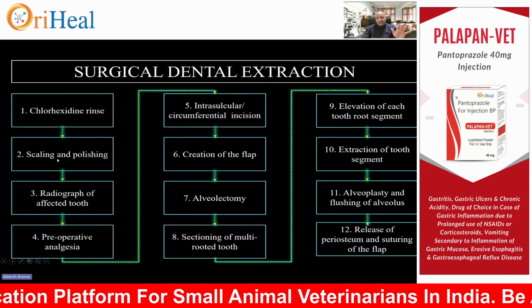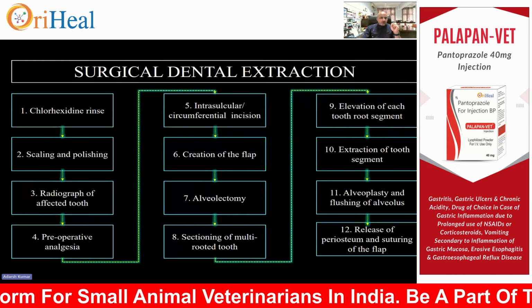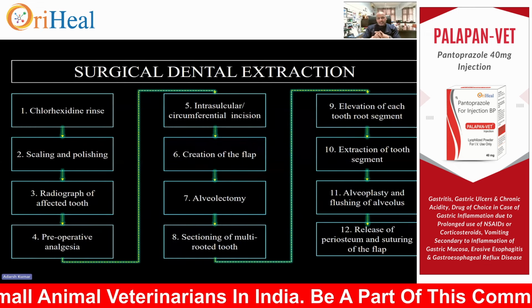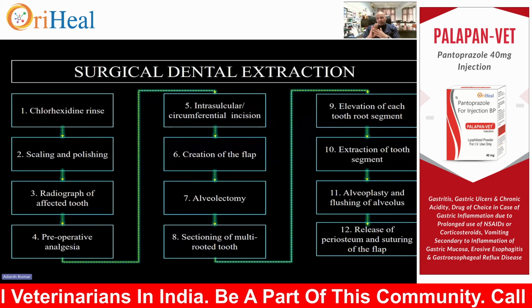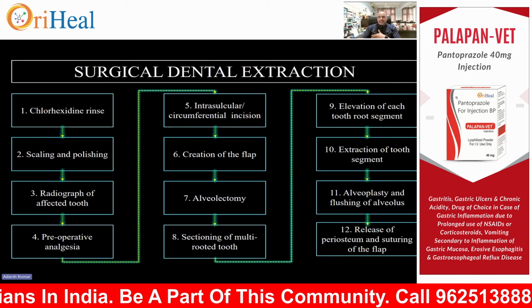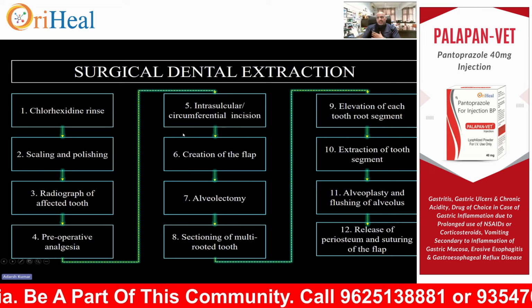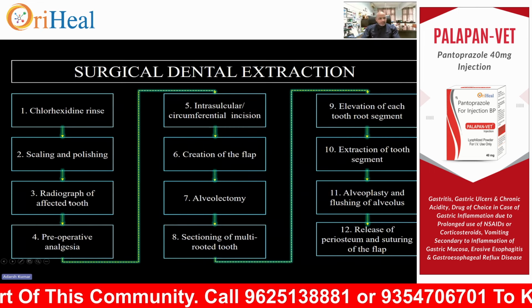Then you do a scaling and polishing, because almost all the teeth which are meant to be extracted or loose have a periodontal problem. You have to solve the periodontal problem. You have to do the x-rays, and then you decide what number of teeth are to be removed from the mouth. So scaling and polishing, then you go for the radiograph of the affected tooth, right?